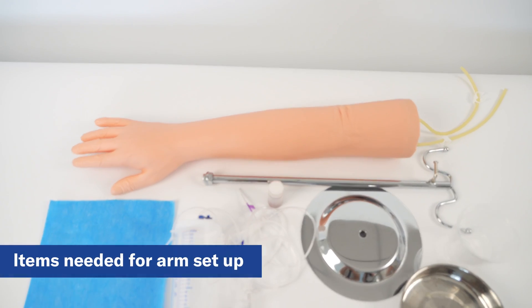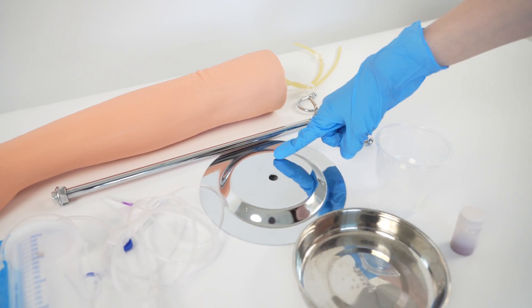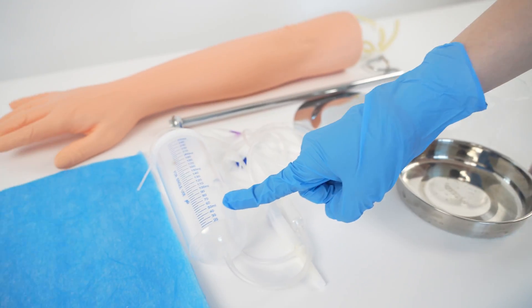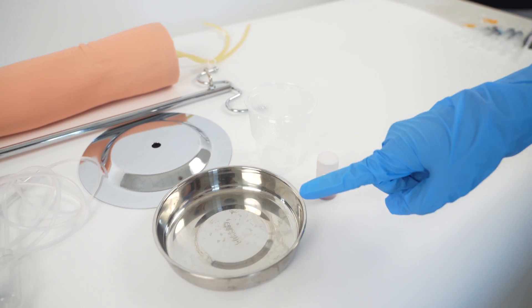For the setup of the simulation kit, you will be needing the following items: the simulation arm, IV stand, reservoir bottle with tubes, blue absorb pad, fake blood, a cup, and a small container.